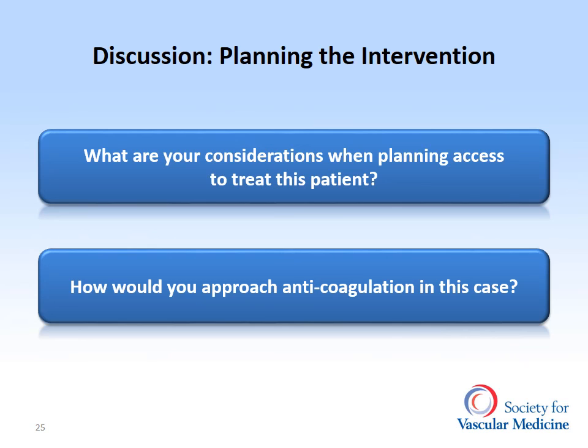With respect to anticoagulation, similar options are available as with the first case, and heparin may be a better choice given the need to cross a CTO and the possibility of need for reversal in the setting of perforation.